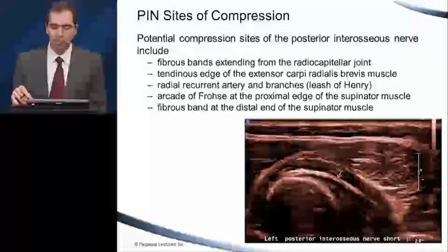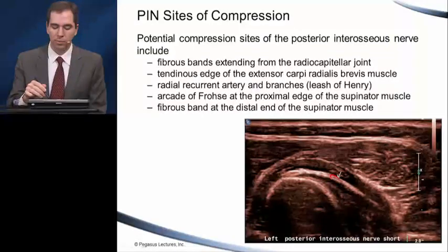So we follow it into the supinator. It becomes more flattened, and that's true in normal individuals who are asymptomatic as well. And then you can follow it all the way to the distal end of the supinator.